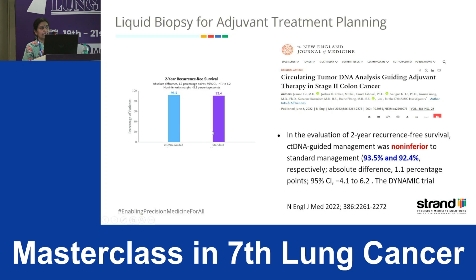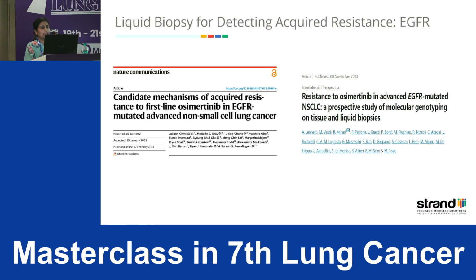So in these two, it has been proven, and it is coming into use. Now, in NSCLC, I didn't find an absolutely clear use case, but nevertheless I thought it useful to point out some studies which are looking at it in some detail.